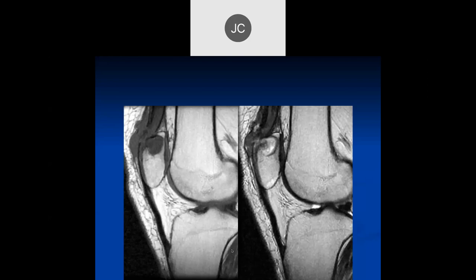There is soft tissue thickening along the distal quadriceps tendon with erosions at the superior patella — this is very characteristic of gout. Notice the sharp margins of the erosion; on CT these would be very sharp, pointed margins, unlike the blunted erosions seen in rheumatoid disease. The superior pole of the patella is a common location for gout, almost as common as the first metatarsophalangeal joint, though slightly less so.